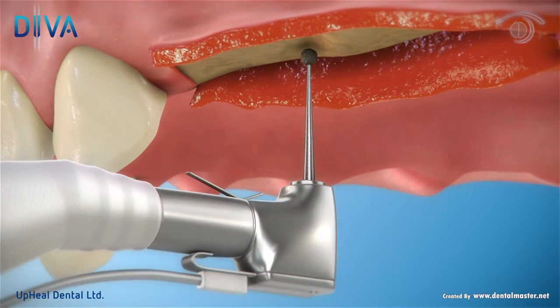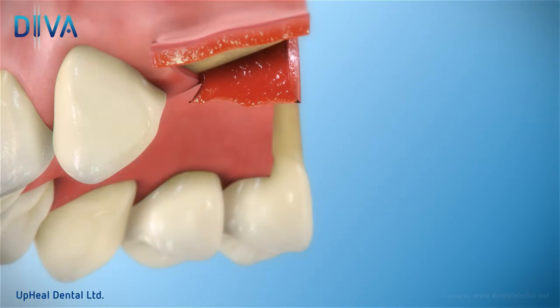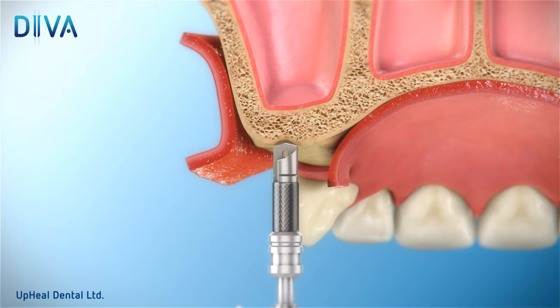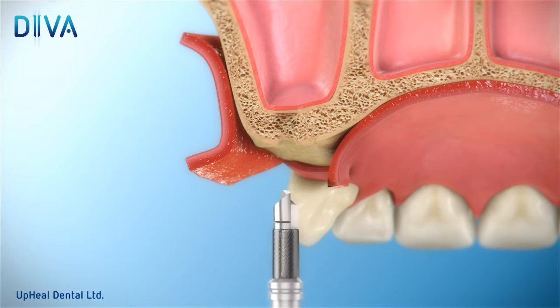Start by using the round bar to indicate the exact location of the implant. Begin drilling with a pilot drill until a depth of one millimeter beneath the sinus floor. It's best to use a drill stopper to achieve the correct depth.